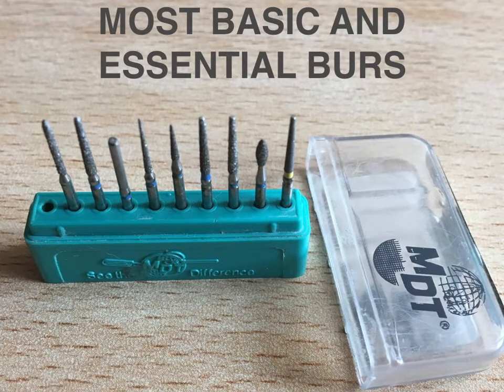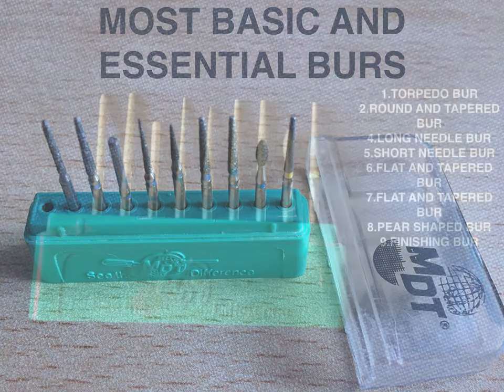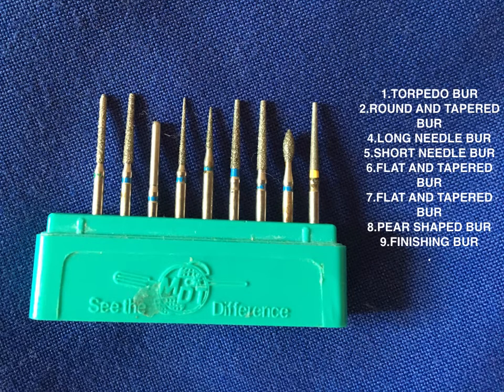These are the most basic and essential burrs that you will require. From your left: the first is the torpedo burr, the second is the round and tapered burr, the fourth is the long needle burr, the fifth is a short needle burr, the sixth and seventh are the flat and tapered burrs, the eighth is a pear-shaped burr, and the ninth is the finishing burr.